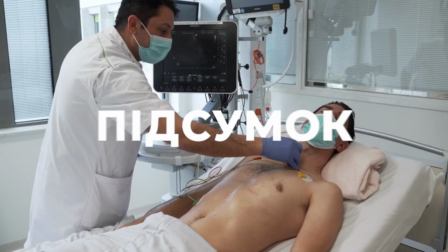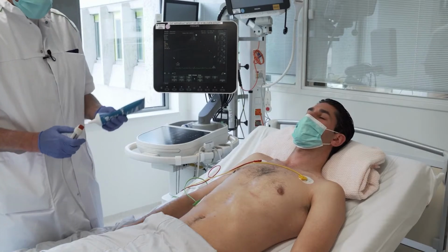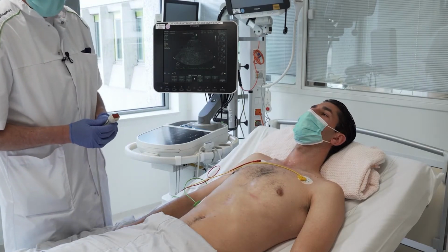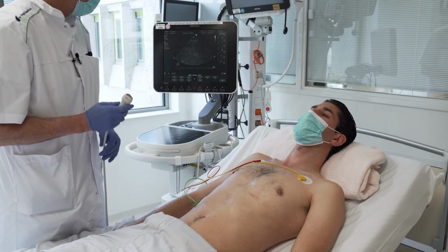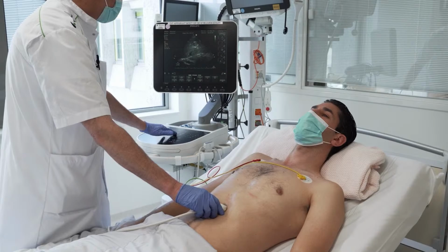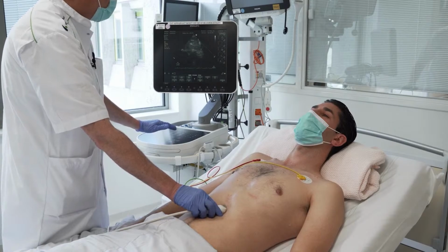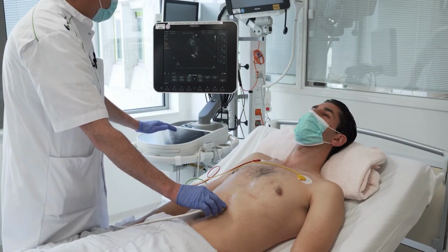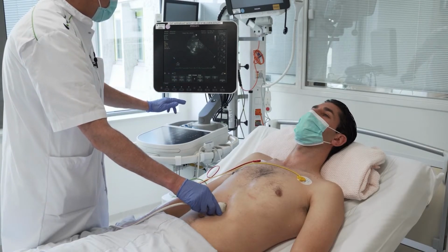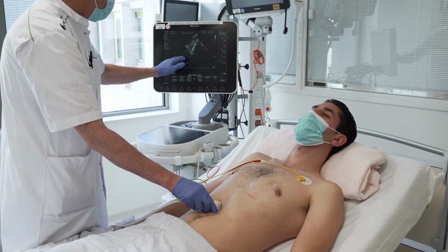All right, I shall try and show you all the windows the way we do it in the acute setting. So it's 9 or 10 windows, and you can do it really fast. So again, I usually start with the subcostal. This is the 4-chamber view we showed. From here you can do the vena cava. You can do the axial view. Here's the left ventricle.